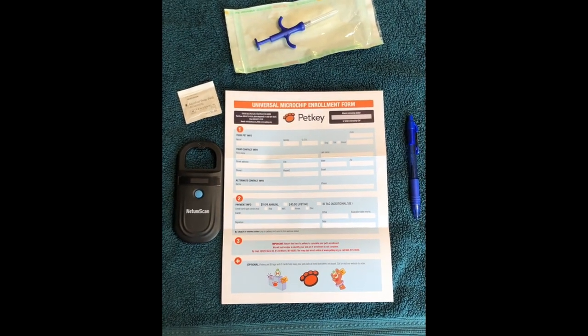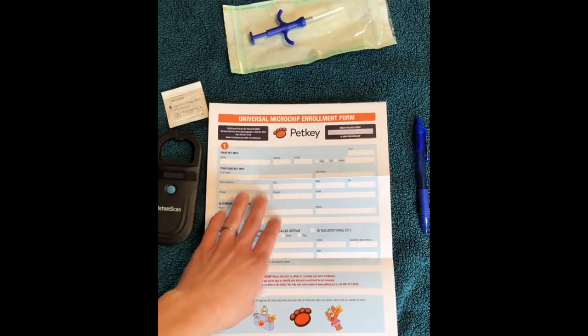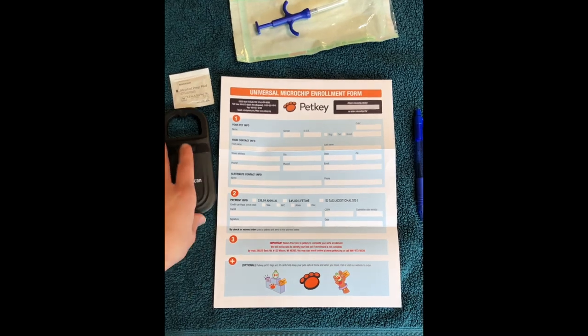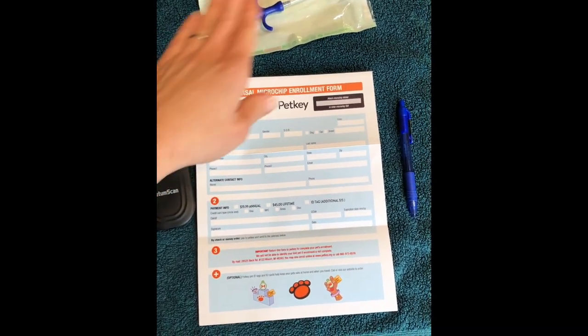We're going to microchip Levi today. This is what comes with your puppy when you purchase from us — you'll get this same form and we insert the microchip. Sometimes the puppies are a little bit too small; if they're too small we'll send this in the sealed package. I've got it open just so it's ready to go.